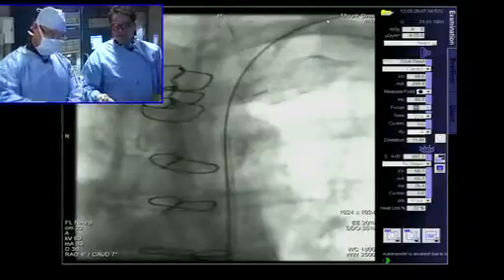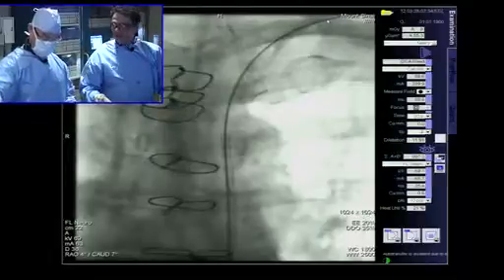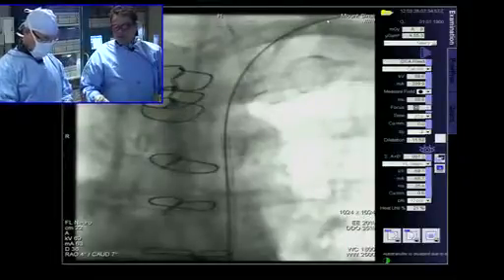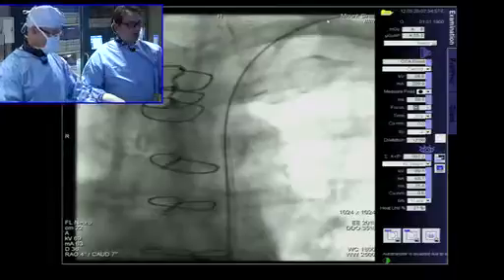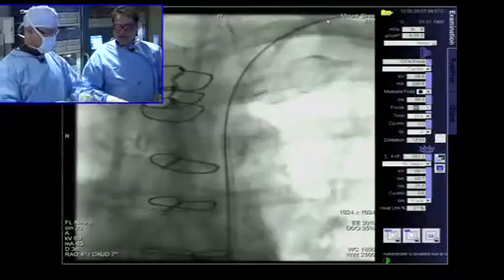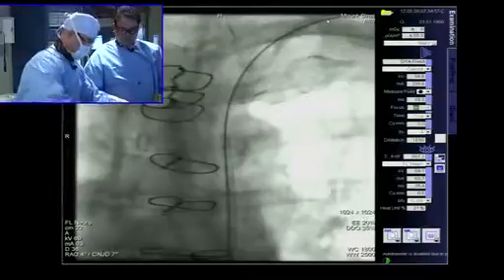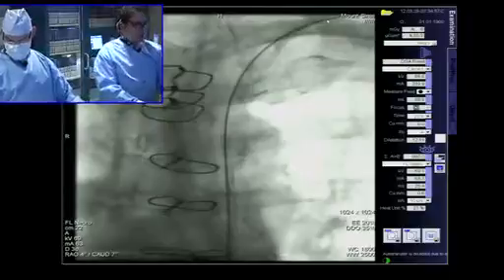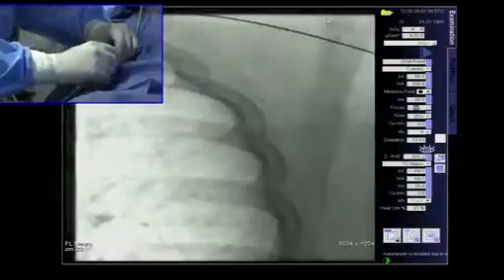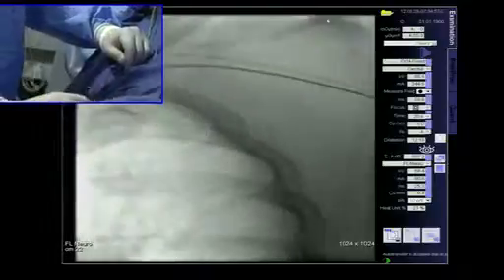Right, and this is part of the limitations of what we deal with, as you know very well. To be able to work with really bulky equipment, sometimes even though the vessels are large, lots of calcium and other things really work against you. And all the techniques like taking a deep breath and things like that, things we use in the coronaries, really don't work in the peripheral. So fortunately or unfortunately, we're dealt the cards that we have and the equipment that we have. So what we try to do is get the wire way out like we have now, and obviously we're going to be on the stiff part of the wire.